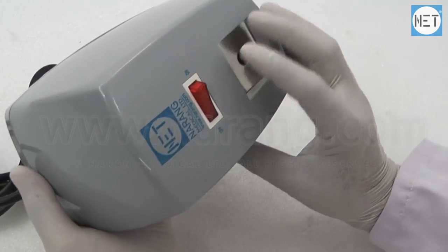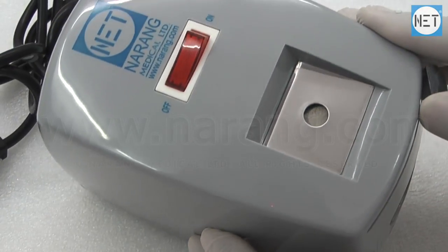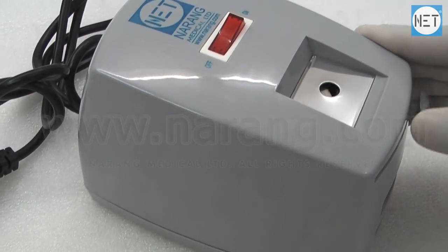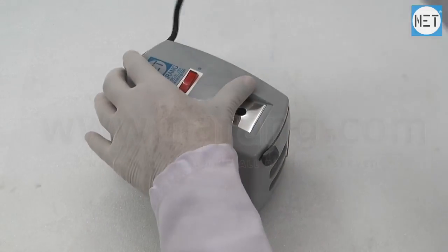The machine is provided with an instruction manual. It is equipped with a needle burner and a hardened and rust proof stainless steel cutter to cut the syringe nozzle after use.